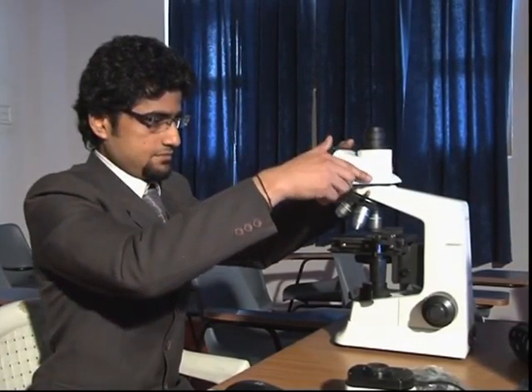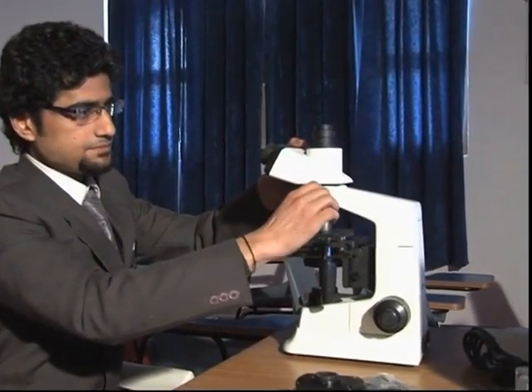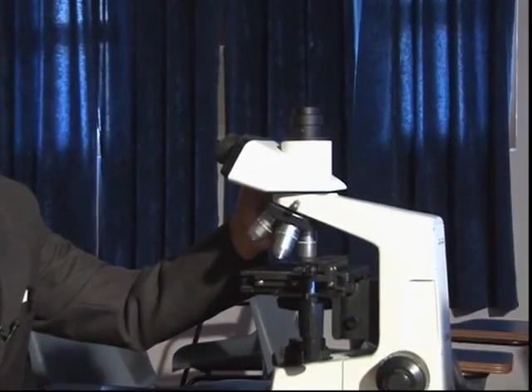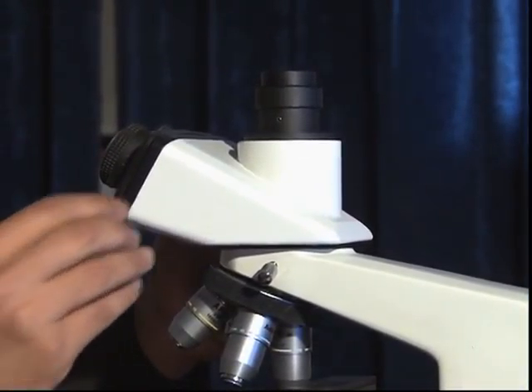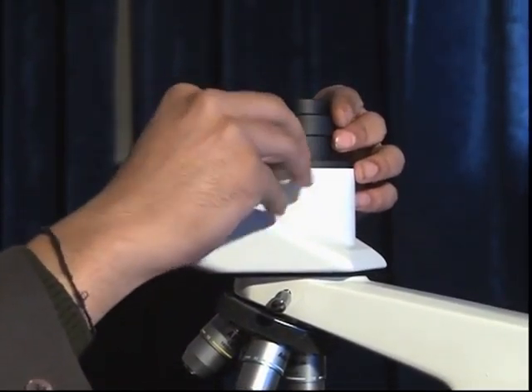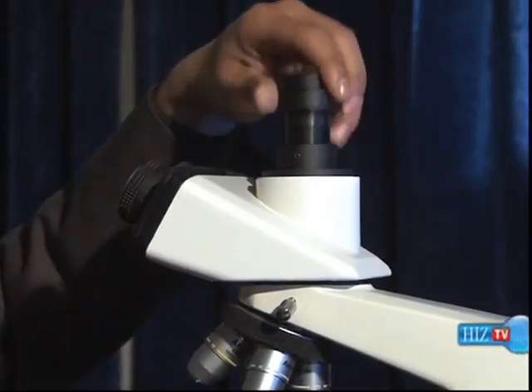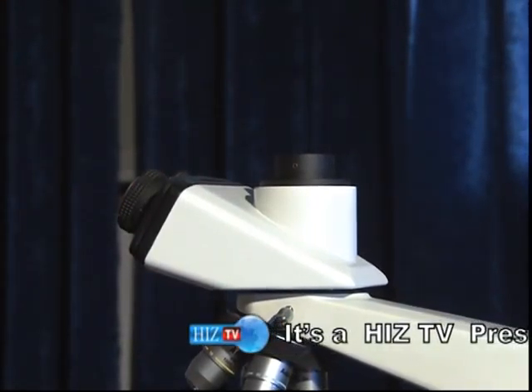Next, we attach the head of the microscope. Attaching the head, we tighten the screw in this manner, and then we attach the camera to the head. We use an LNKey to open the cap of the head and attach the camera to the head.